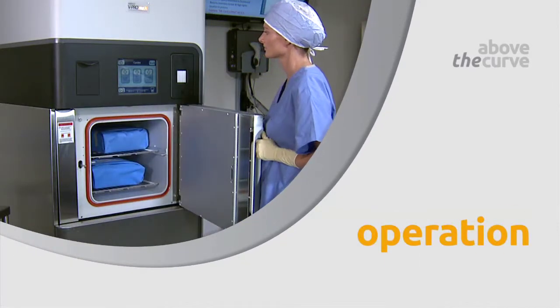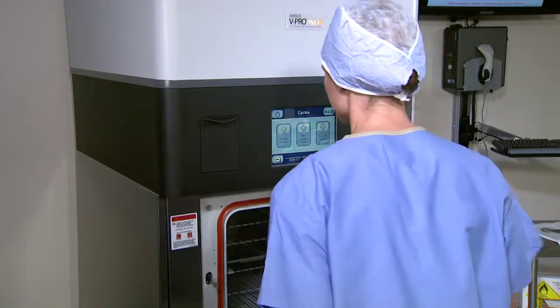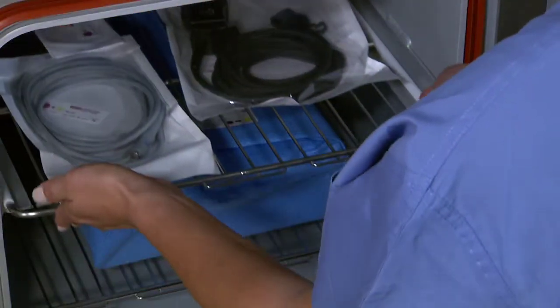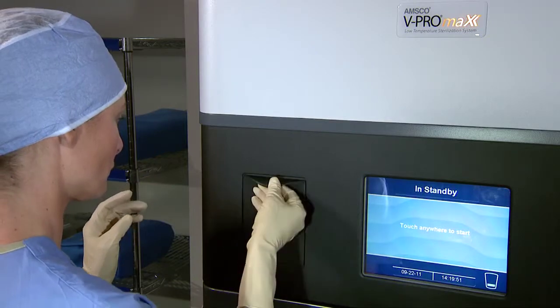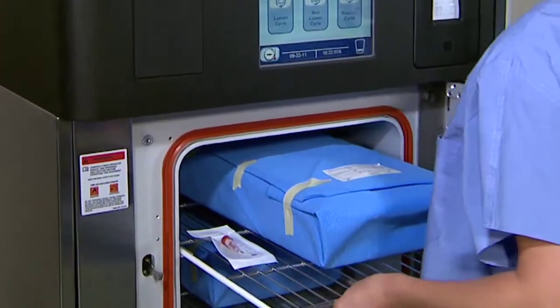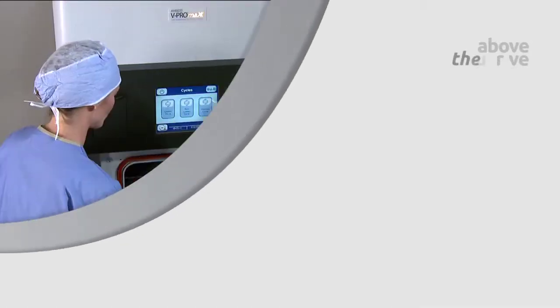When it comes to operation, V-Pro Max is above the curve in ergonomics and ease of use. Our handle-free door design promotes one smooth motion for opening and closing. Ergonomic sliding shelves make loading simple. Our plasma-free process does not require a space-constraining electrically charged coil inside the chamber, allowing for more usable chamber space. The large display is easy to read and features enhanced screen navigation.